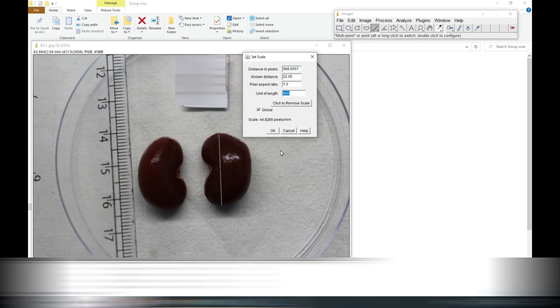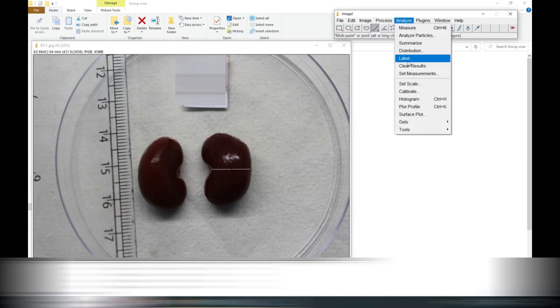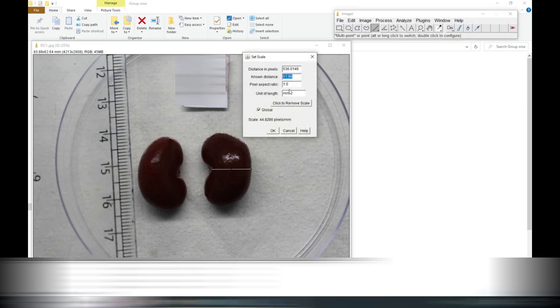Say okay, write it where you want to add and now we will see how to measure the width. You can select the center part as a width only. If you want to do more appropriately then you have to take three width measurements. This upper part, now you can see the kidney width.